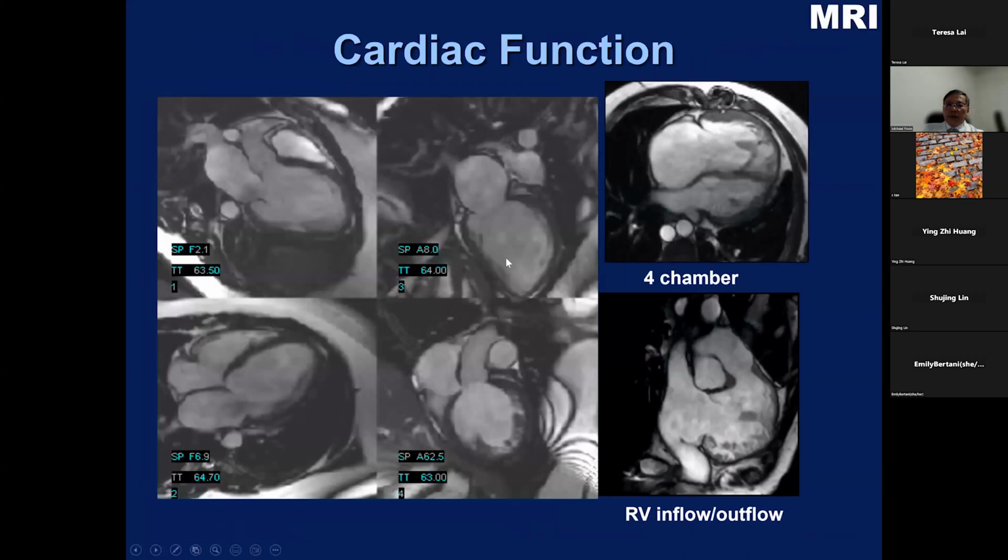So this is some of the picture that we do using MRI. You can see that there's no blind spot. You can see everything, both the right and the left heart. Typically, the echo is not good for the right heart. You can see the left heart pretty good, but right heart, no good. And this is a patient with pulmonary hypertension, and you need MRI to see this.